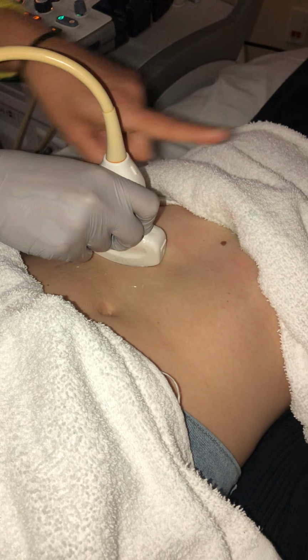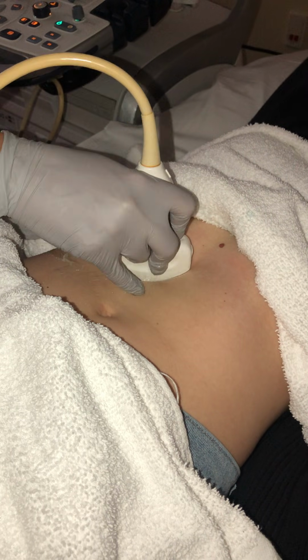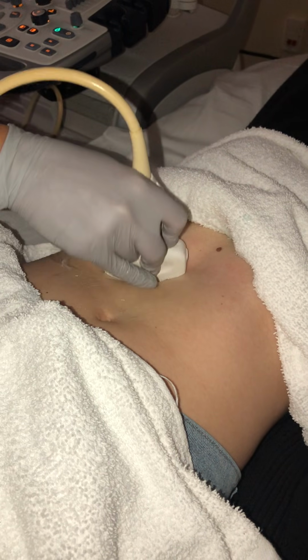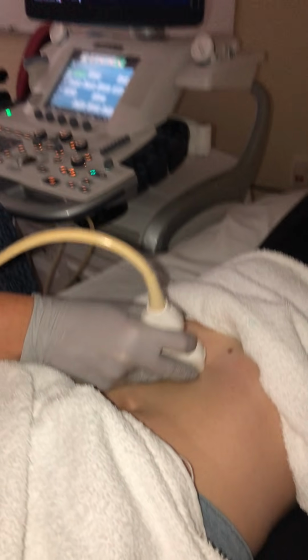My notch is pointing up towards her left shoulder. And let's see what that gets us. And then similar to the pancreas, we're going to sweep under that rib cage and back to try to find that organ. So let's see where we're looking here.